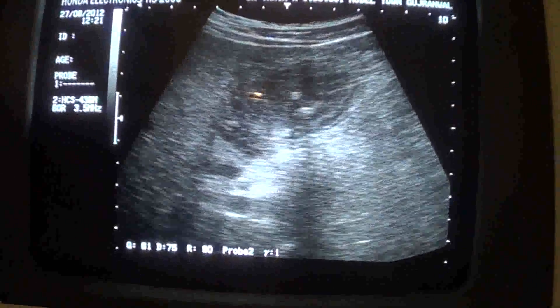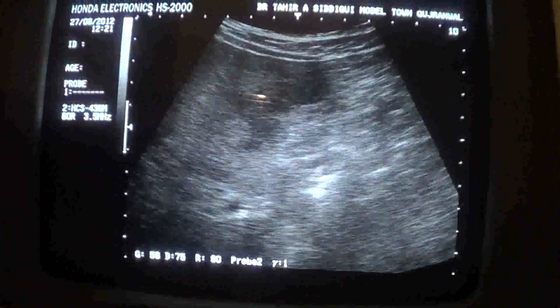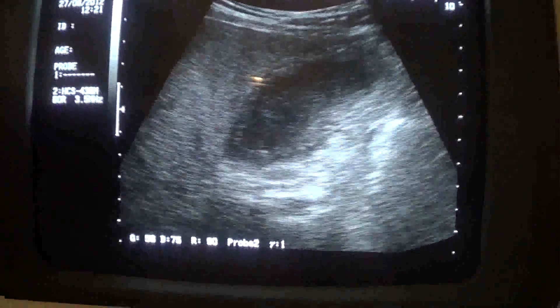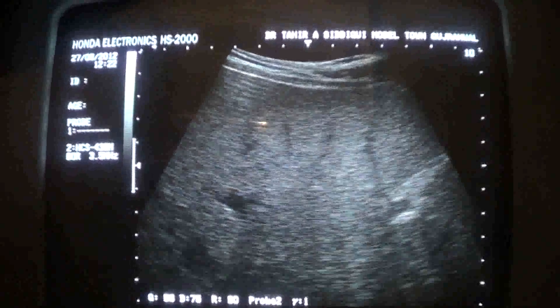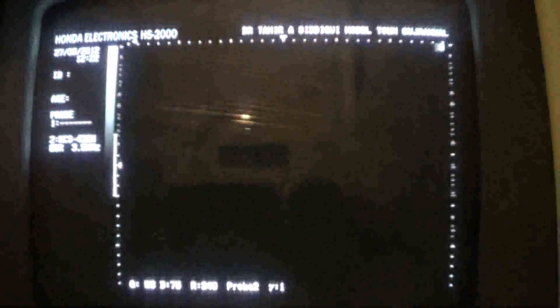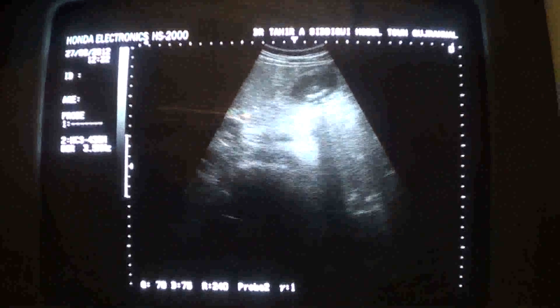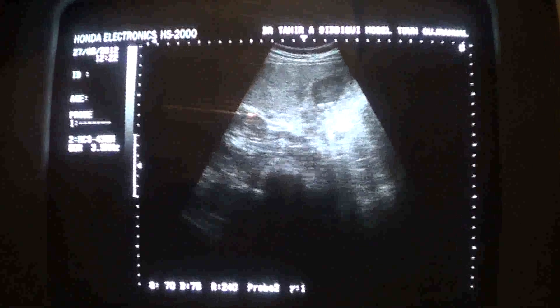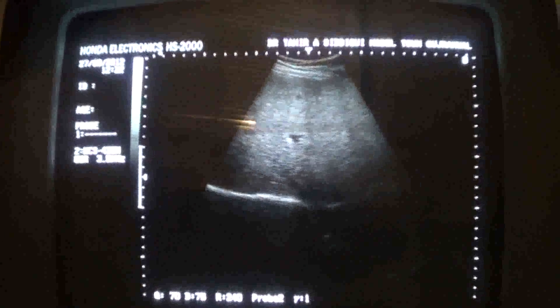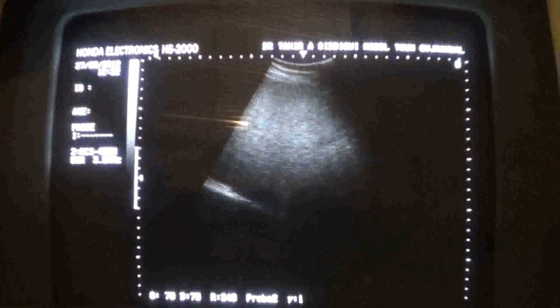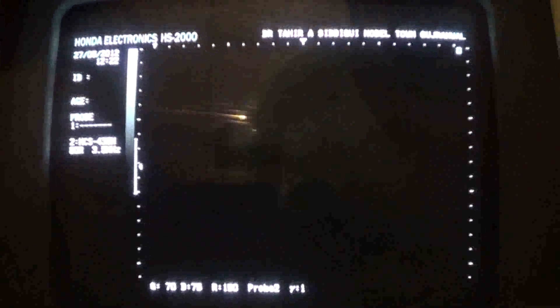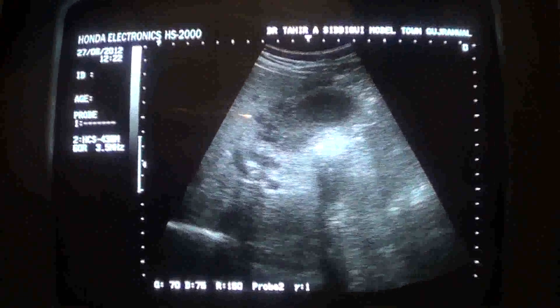This is gallbladder outlet obstruction, which has to be ruled out. There is no evidence of intrahepatic biliary dilatation. Though the liver is fatty, in this transverse view you can see the kidney with renal vein. No evidence of intrahepatic biliary dilatation.